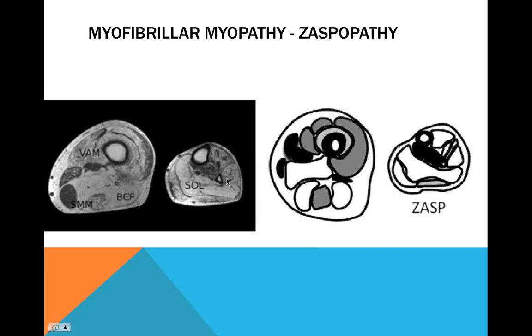So she's just going into nurseries and doing muscle ultrasounds on these infants, and she's going to be putting her data together. But it's an area that's lacking in information for sure. And it's very difficult to get as well because, as you can imagine, infants have a lot of subcutaneous fat to go through. They're super pudgy, and it's hard to get a good visualization of the muscle. Additionally, they tend to move a lot, and it's hard to steady them. So it's hard to get a good view.